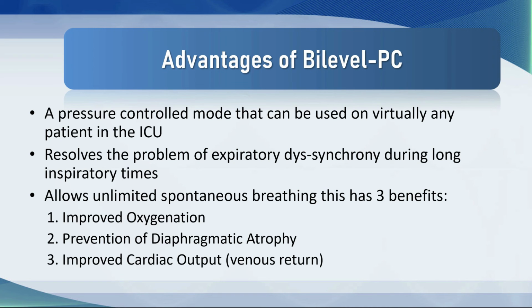1, improved oxygenation. 2, prevention of diaphragmatic atrophy. And 3, increased cardiac output due to improved venous return caused by the slight negative pressure that's generated in the thorax during those spontaneous breaths. And do not underestimate the value of this in terms of ventilation perfusion matching.